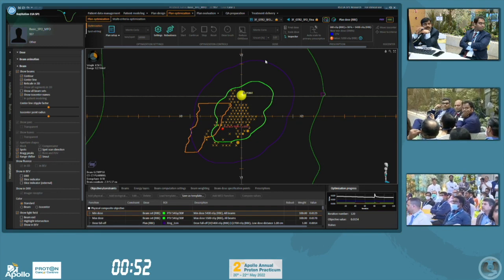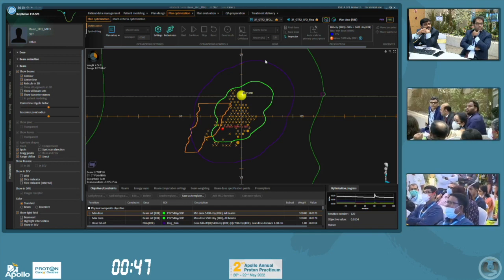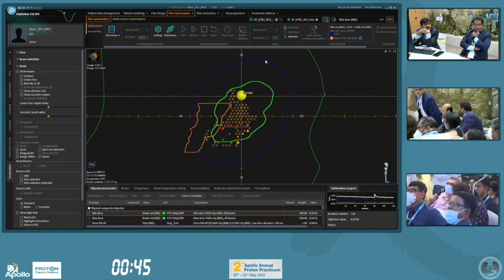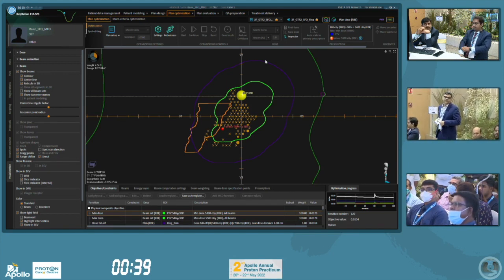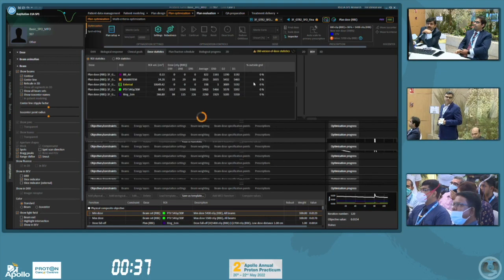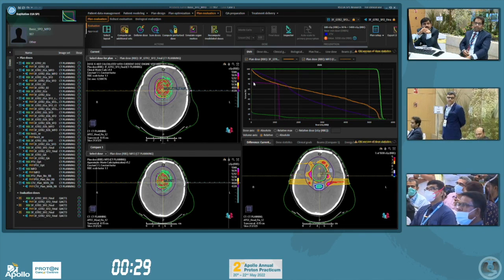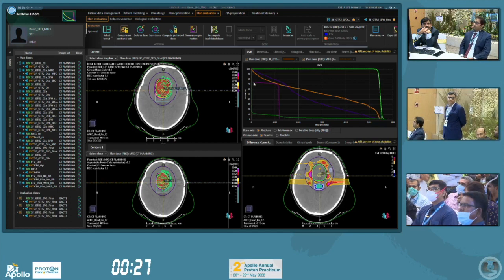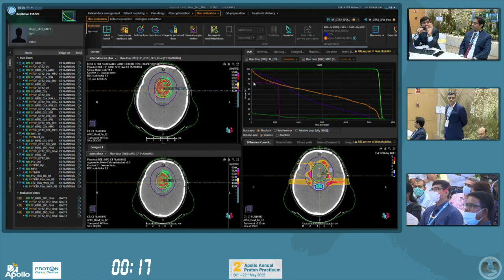So, Naufal, just one more thing. Earlier you were saying that we always do the planning on the CTV and put in the robustness. Before the optimization, you don't put in the PTV, but you go with the CTV with the uncertainties. You define the uncertainty scenarios to plan for. So in that scenario, do you actually have a volume to quantify the dose deposition? Yes. Because the dose will definitely be spilling out of the CTV that you have, right? Exactly, it should be. Because that's what I said, you have to produce a cloud.